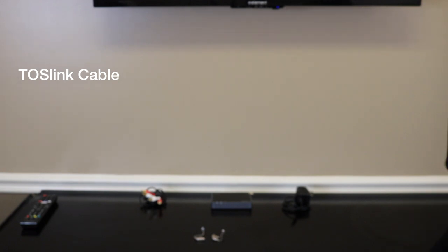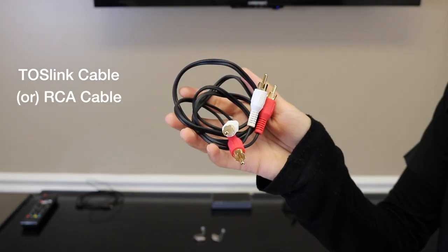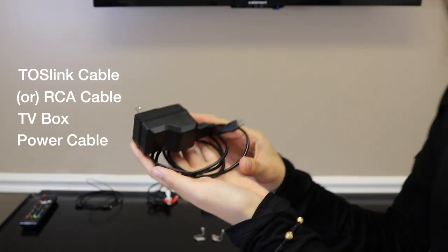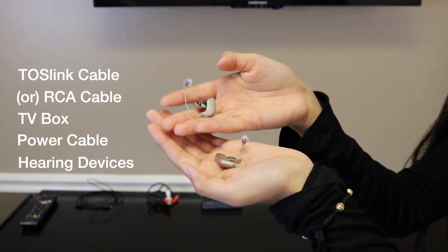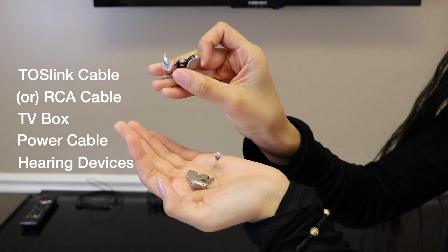For this process you're going to need your TOS link cable, your RCA cables, the adapter box, a power cord, and also your hearing aids. For this process, the battery doors will need to be opened.